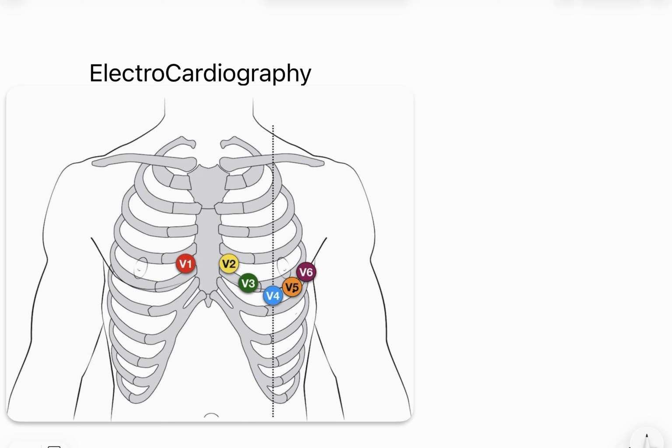An ECG is a test that checks the electrical activity of your heart. In a previous video we mentioned the cardiac conduction system, and in detail we said there is the SA node, AV node, bundle of His and Purkinje fibers which transfer the cardiac impulses and help in the contraction and relaxation of the heart. So the ECG is a record of the electrical activities of the cardiac cells. It records the impulses transferring to the cardiac muscles, and thereby helps us understand if there is any delay or any issues in the cardiac conduction system or in the contraction and relaxation of the cardiac muscles.